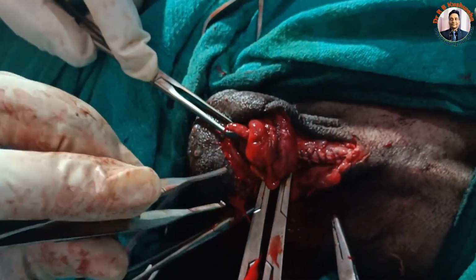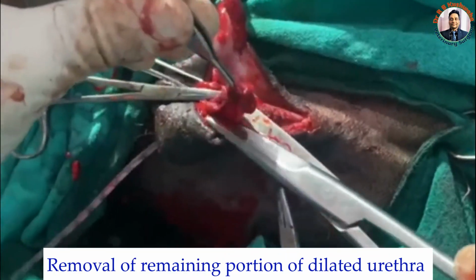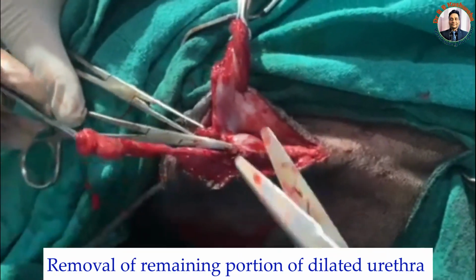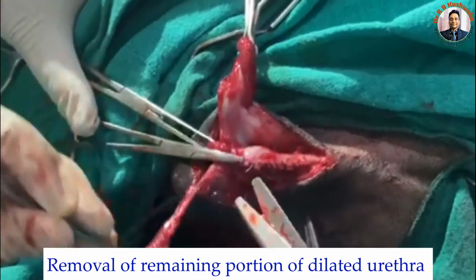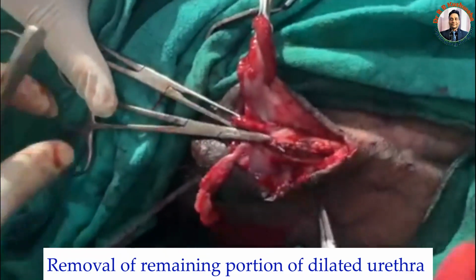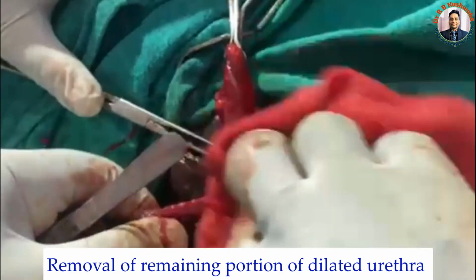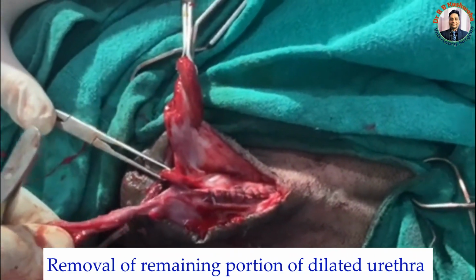So similarly here we remove from the lower side. So we have to cut this extra portion of the urethra. Leave it.